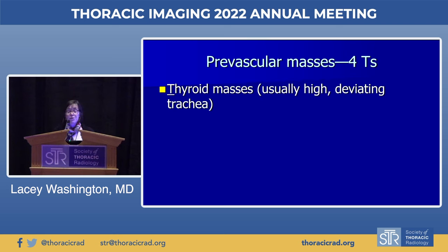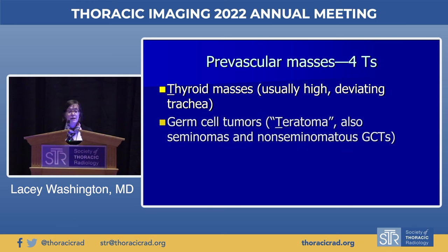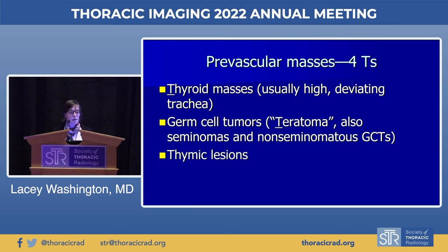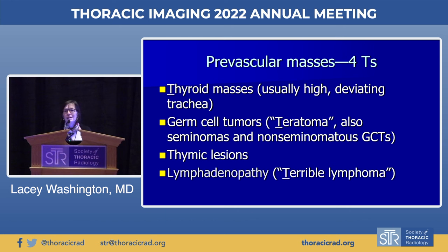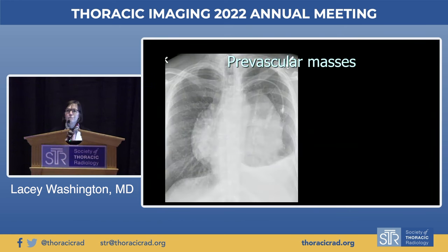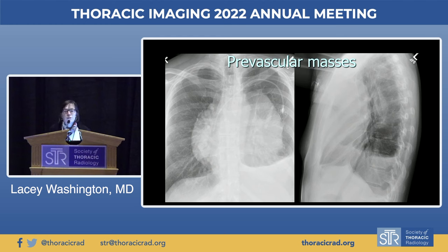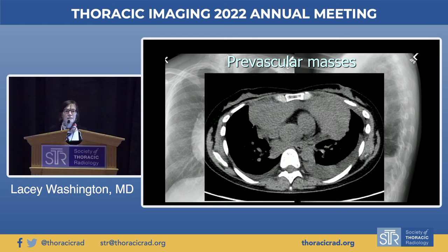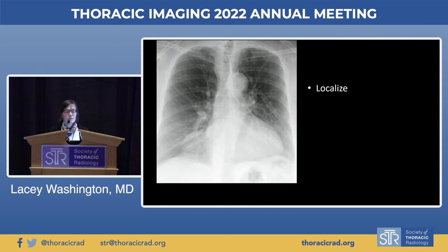We all know the differential diagnosis for prevascular masses — the classic four T's: thyroid masses, which are usually high and may deviate the trachea; germ cell tumors, which include teratomas, seminomas, and non-seminomatous germ cell tumors; thymic lesions; and lymphadenopathy, which can be in any compartment of the mediastinum. This prevascular mass, confirmed on the lateral view and CT, is a large anterior mediastinal lymphoma.